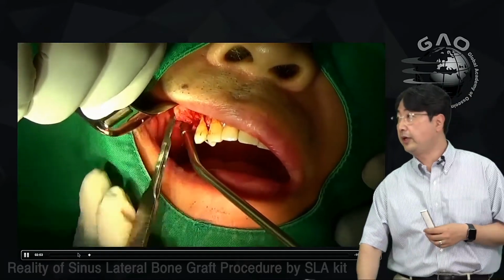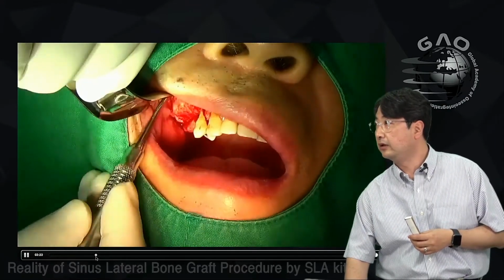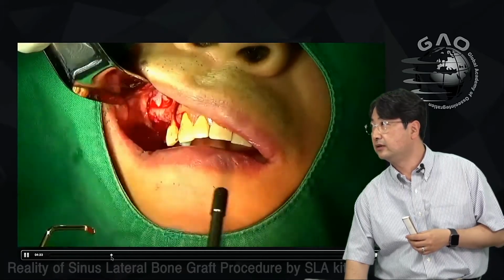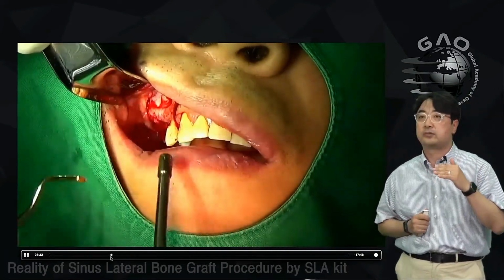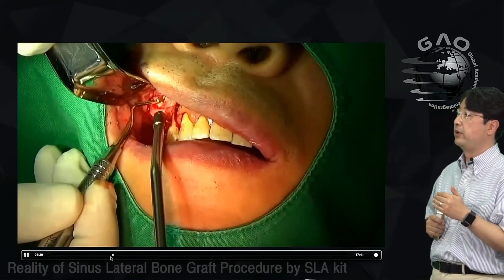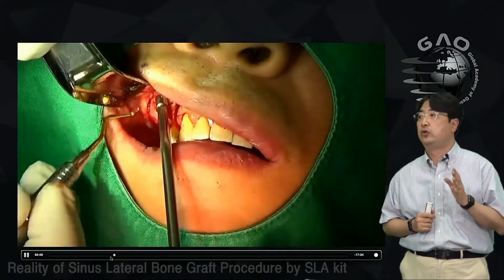This is a very careful procedure, right? You don't want to have sinus membrane tearing again, right? And believe me, you have to have enough time to do this. Now I have separated the periosteum and the muscle. Now you can see the previous window, the previous opening from the previous sinus graft, right? I do the same. I use the Freer elevators number 1, 2, 3, right?